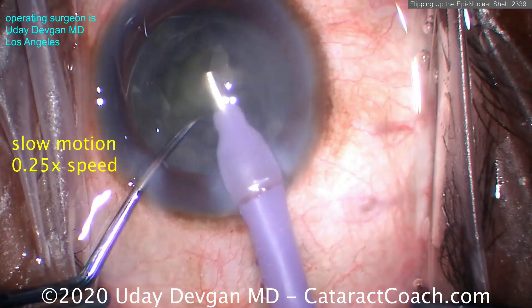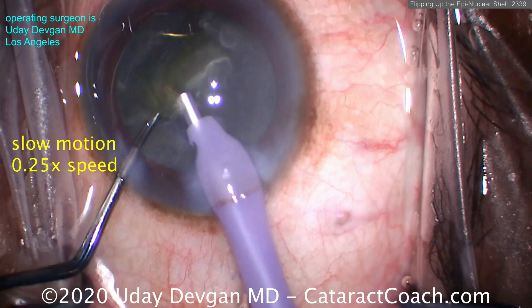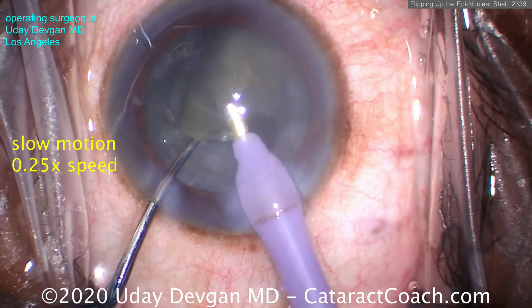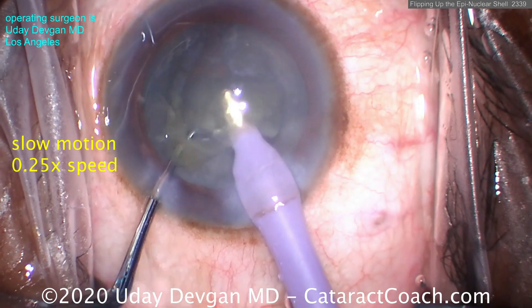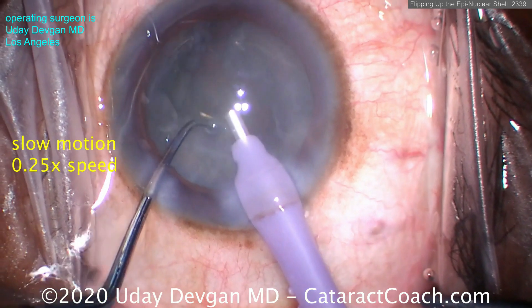That's how I like to do it for most of these cases. Now, depending on how you do it — watch carefully here — we grab... just joking, you're grabbing the epinuclear shell, nice and easy. Here are some last cataract pieces coming out; those are fine. Once those are out and the probe's clear and pieces aren't coming to us anymore, we need to grab the epinuclear shell.